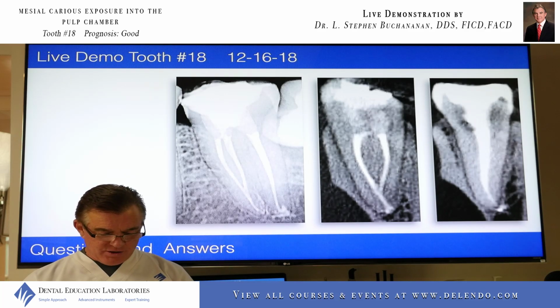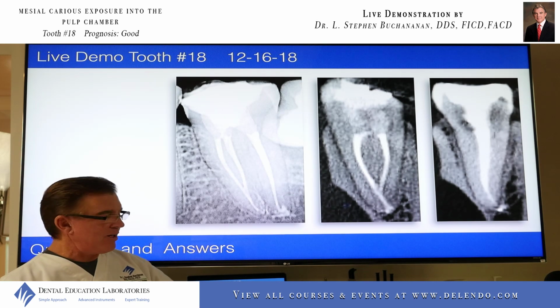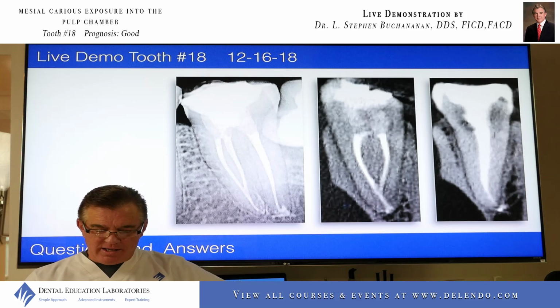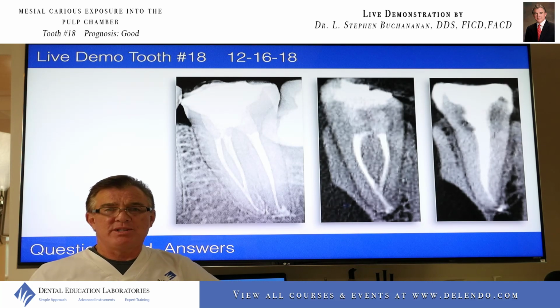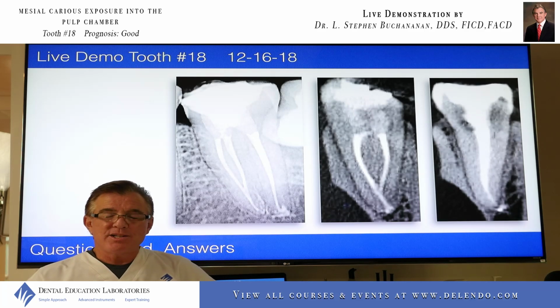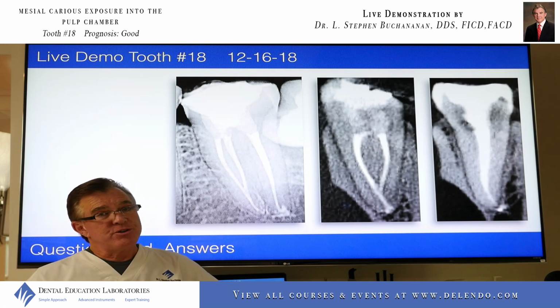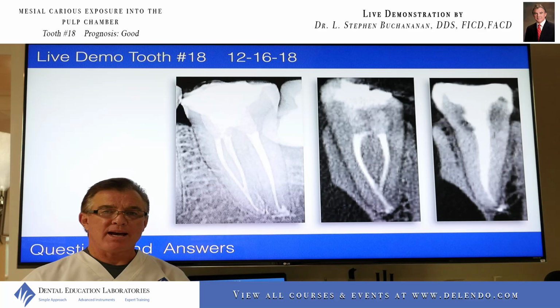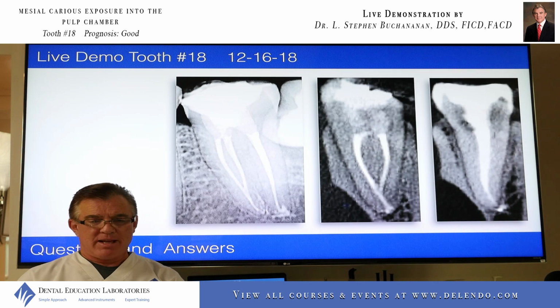How different are the methods I use today versus methods used 5 years ago? That's a great question. And the interesting part of the question is it's only 5 years that we're clocking time here. Usually I look at how many things that we used in dental school do we still use today, and the answer is virtually none. The methods that have changed in the last 5 years, I would say, for sure, dynamic guidance, having a guided access capability to access calcified molars, calcified anteriors. That's huge. That's changed my practice enormously.